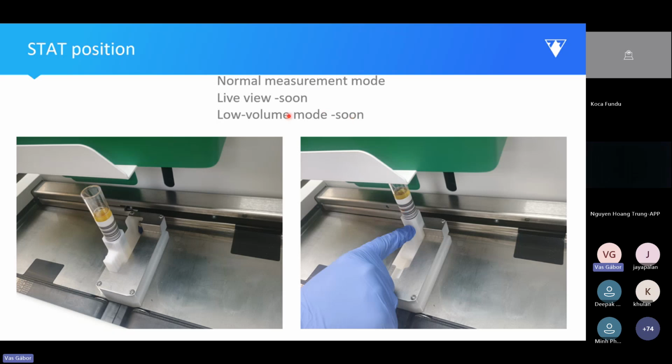Of course, we are planning to implement our very popular live view into this software as well, which means that you can have a live view and you can make your own photos, and you can move the cuvette around as you wish, if you're looking for a rare particle, or you would like to see things in motion, for instance, you're looking for trichomonas.